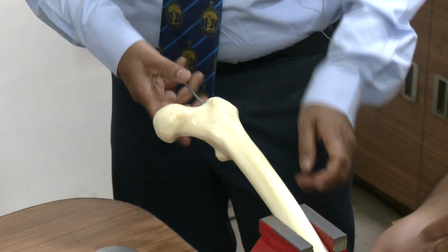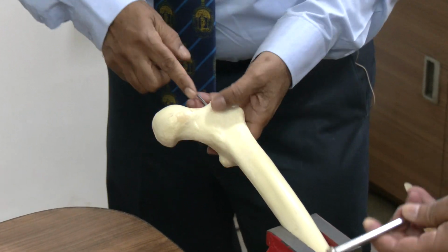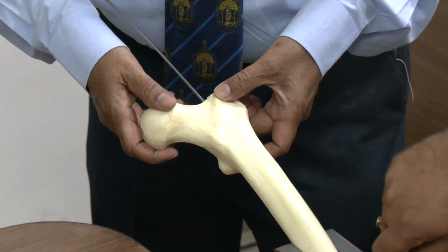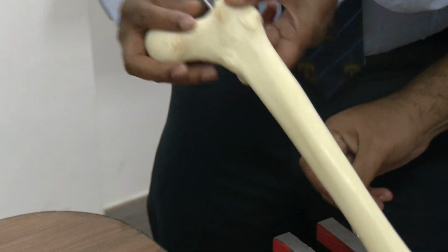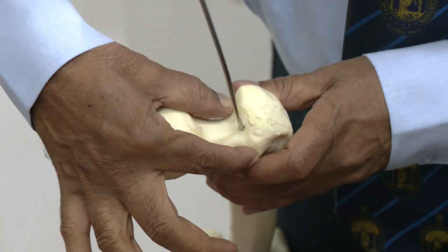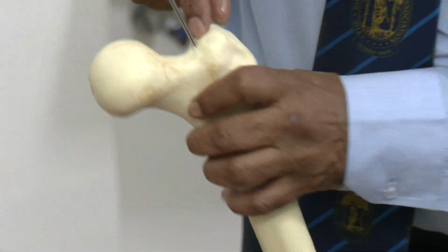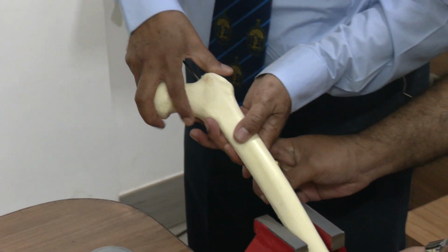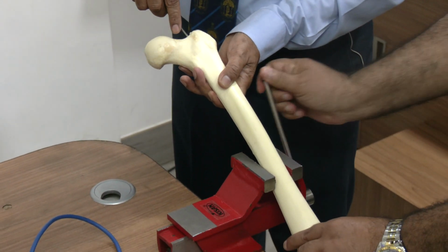Your tip of the wire, you have to feel. So now you can see that it's in the center of the neck in lateral view also, and it is medial to the tip of the greater trochanter in AP view also. That is very, very important.